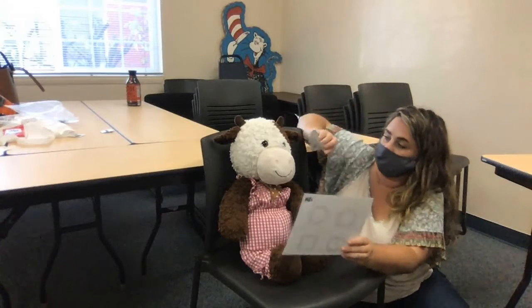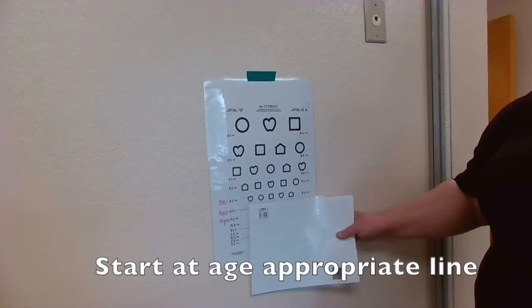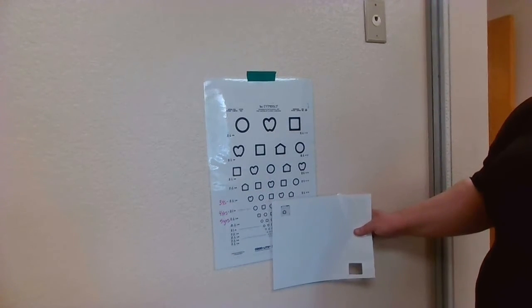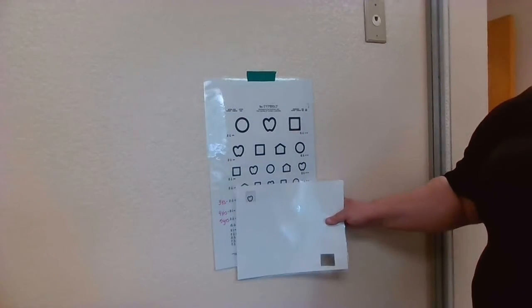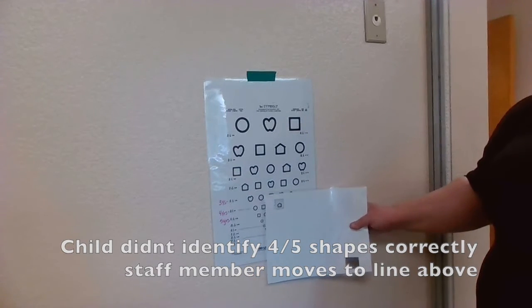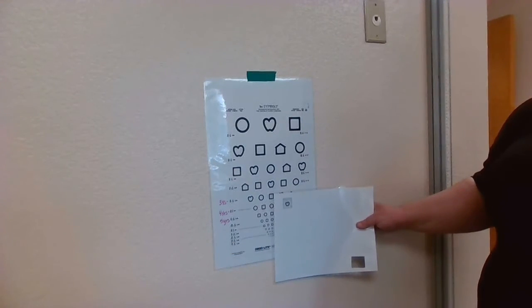Here's a run-through of what a potential fail could look like. Starting at the age-appropriate line with an eye covered, move from shape to shape as stated before. If the child does not get 4 out of 5 correct, you move up a line and begin the process again, moving shape to shape as they identify them.